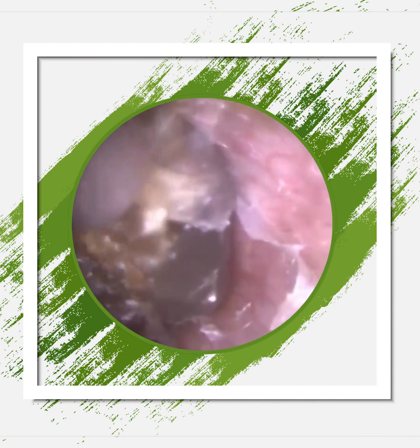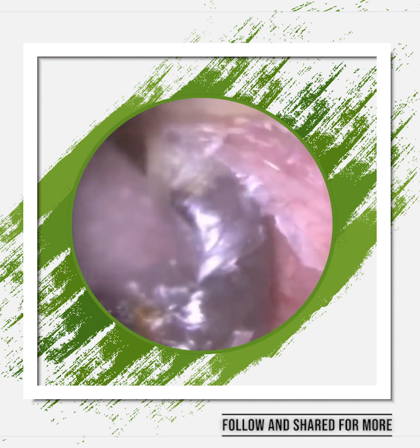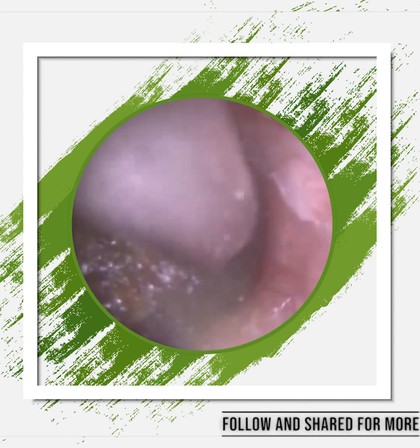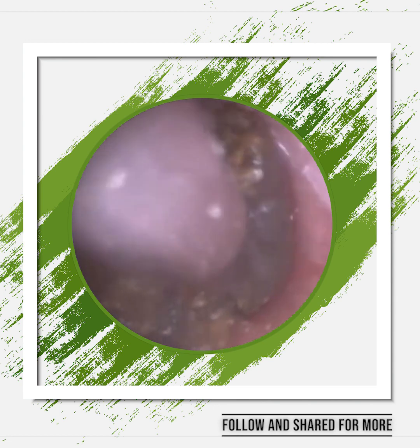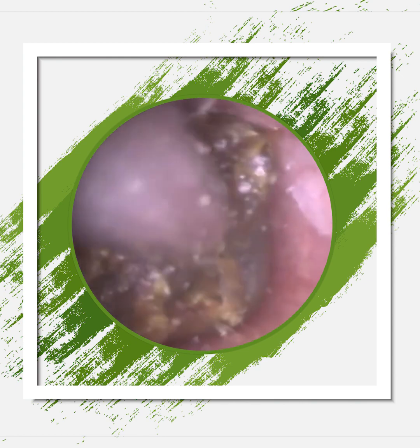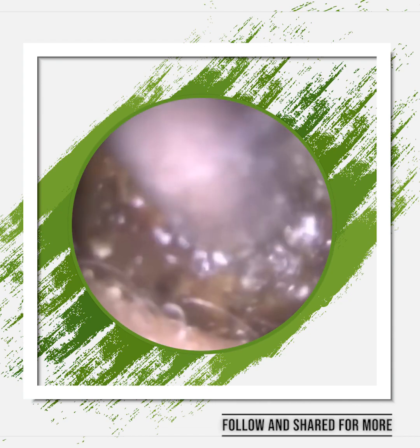So I'm just on the posterior canal wall, so the back part of the ear canal. You can see that layer of skin that I'm trying to peel off the canal wall. We have to be very gentle in this region of the ear canal. The outer third of the ear canal is made up of cartilage, and the cartilage has a thick layer of skin, well, thick relatively compared to the thickness of the skin that lines the bony part of the ear canal. So the skin that lines the cartilage portion of the ear canal is roughly 1 millimetre in thickness. There is also some muscle underneath the skin and some fatty tissue.